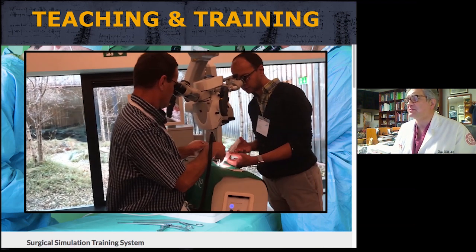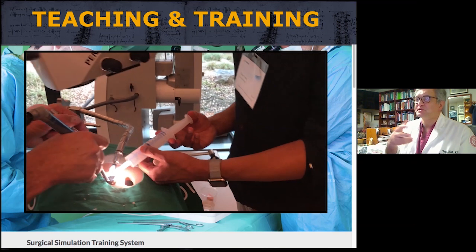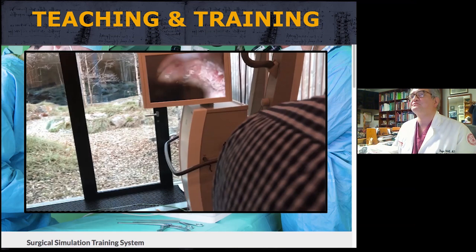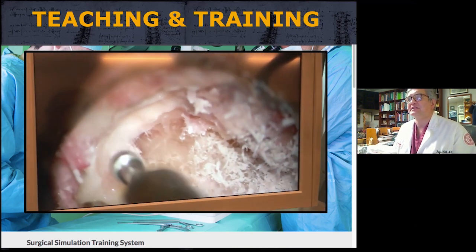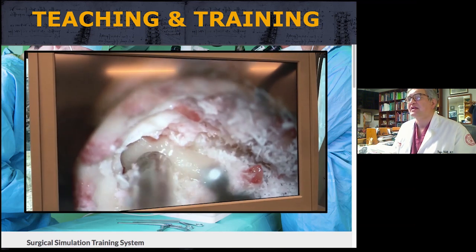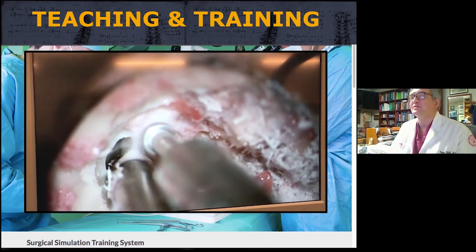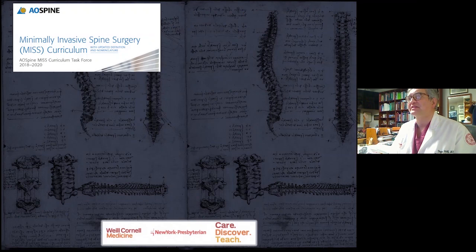And this is really a beautiful technology that allows you to use the microscope, to use the drill, to talk to some of the expert surgeons, how to perform this operation. It's very realistic. And you can see here the bone that this colleague is drilling here with irrigation and suction, and the dura, you can get a CSF leak that you can repair. So that's one of the ways that we're trying to really teach this surgical technology.